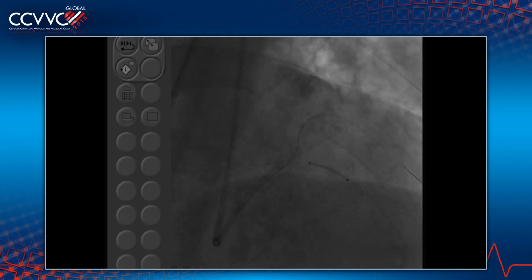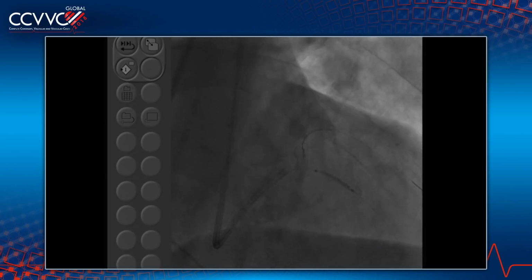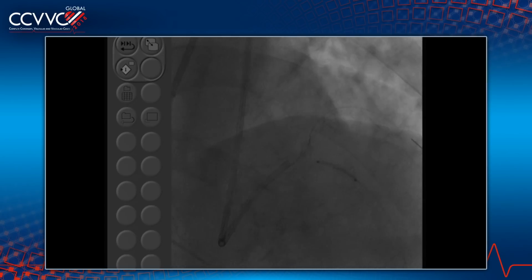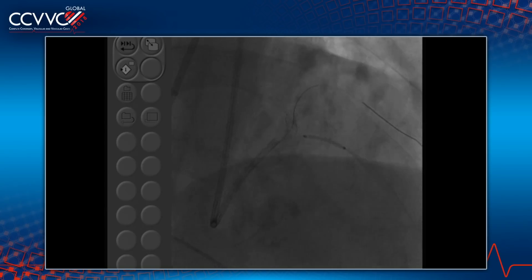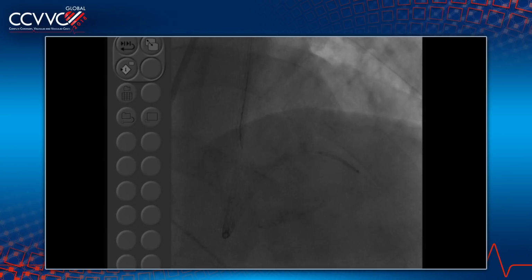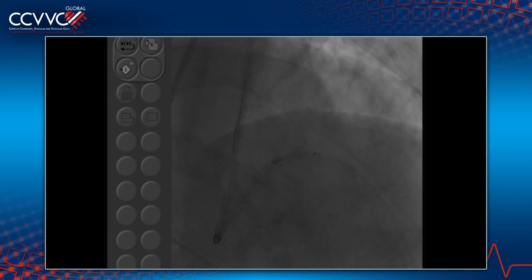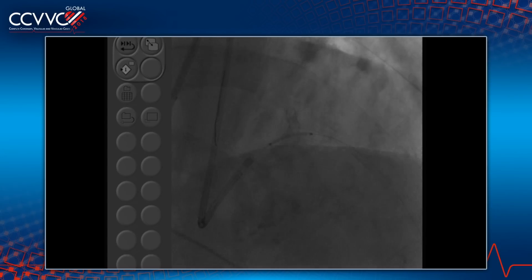This is kind of an unusual view to deploy the stent in the circumflex. Don't you want to be a little more caudal to see the ostium better? I think it looks to me like they have plenty of room, it might not be as many as we might have imagined. I like to take a little test before I pull the wire out, just in case there is a dissection distal to the stent. He did do a little puff, it was fast.